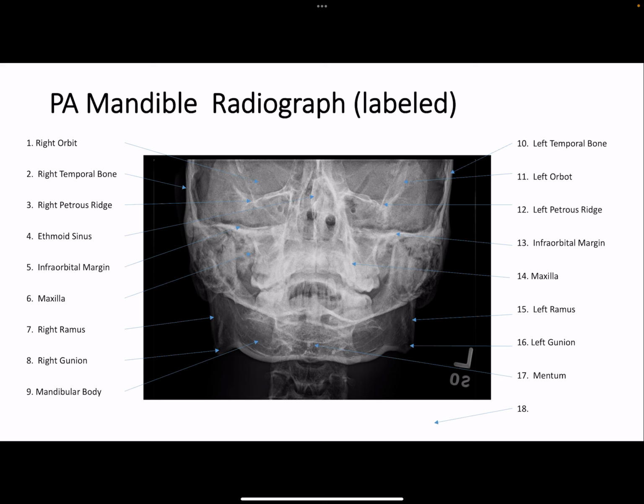Pathology items in profile. Nothing is in profile. Pathology best demonstrated or clinical indications. For this image, clinical indications and pathology shows fractures, neoplasticism, or inflammatory processes of the mandible.